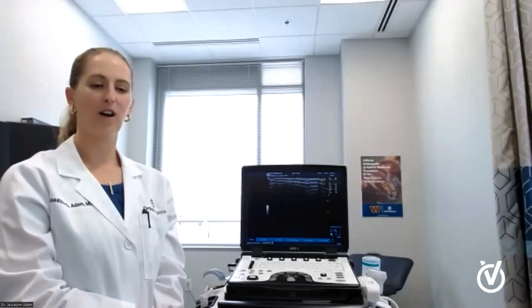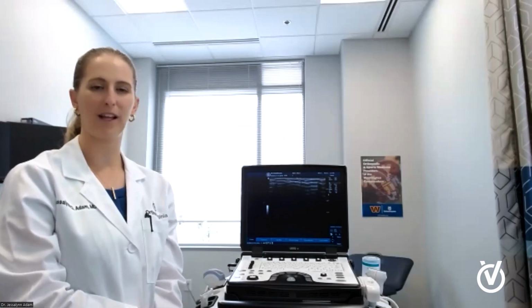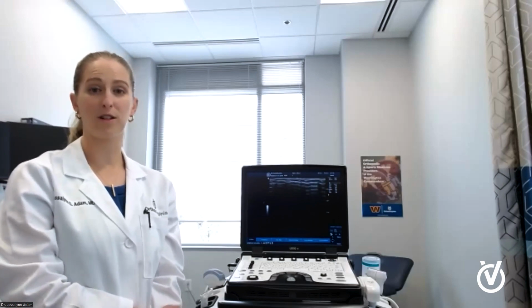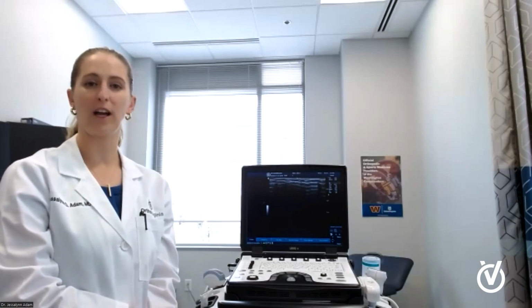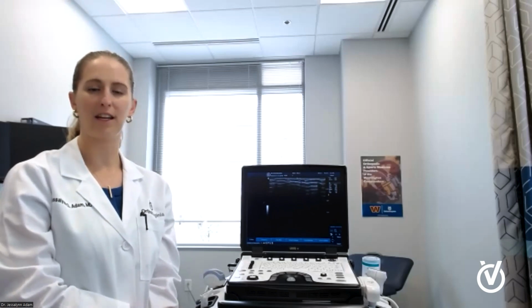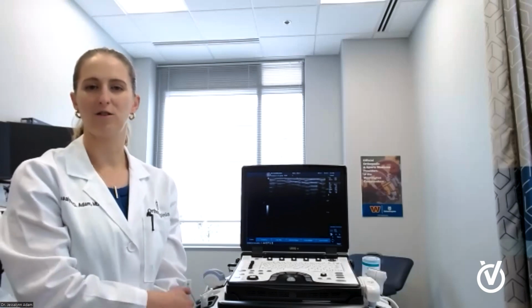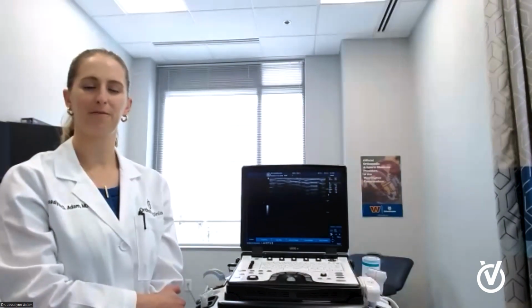What do you mean by having the ultrasound guide a procedure? So in orthopedics, we do a lot of injections. These might be steroid injections, platelet-rich plasma, or various other procedures. And so say you needed a cortisone injection in the hip. In order to make sure that the needle is going to the right location safely, I can use the ultrasound to guide the needle. So as the needle is being inserted and directed towards the hip joint, I can track its progress all live, real time.